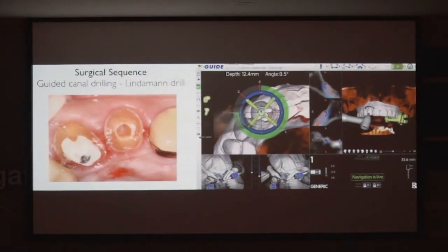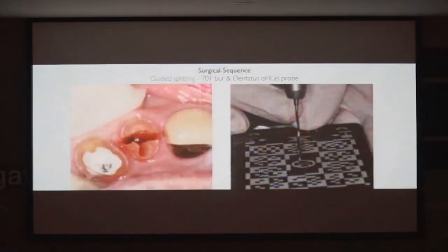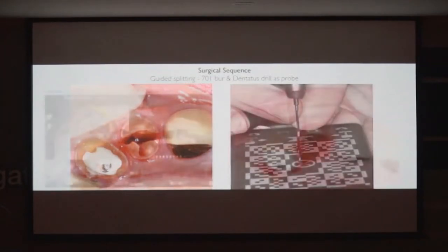There's my osteotomy down the implant right to the apex. And if you're right against the buccal plate, it's okay. You can feel it with your finger. It's interesting to see how accurate this system is. And you can see how I'm cutting. There's the virtual tooth. Now I've gone to the apex, and then I split it laterally with a straight 701. And I'm going to use this to feel inside there and look and make sure I haven't cut through into the adjacent teeth.